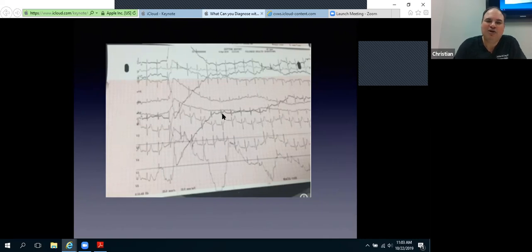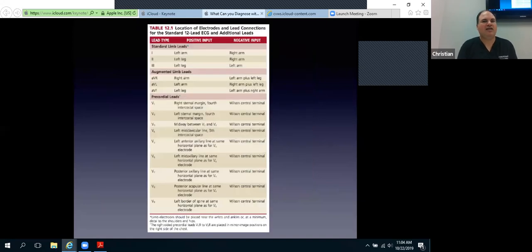The purpose of this is it shows you how difficult it is to get a quality EKG if things are falling off you. In this situation, I've been running, I'm sweating, things aren't sticking to me very well. It's very difficult on our pre-hospital personnel to get an EKG in the back of a moving ambulance with the wires swaying and moving. So the fact that the quality of the EKGs are not good isn't necessarily a critique of them. It's a critique of the technology and the problems that exist for them.